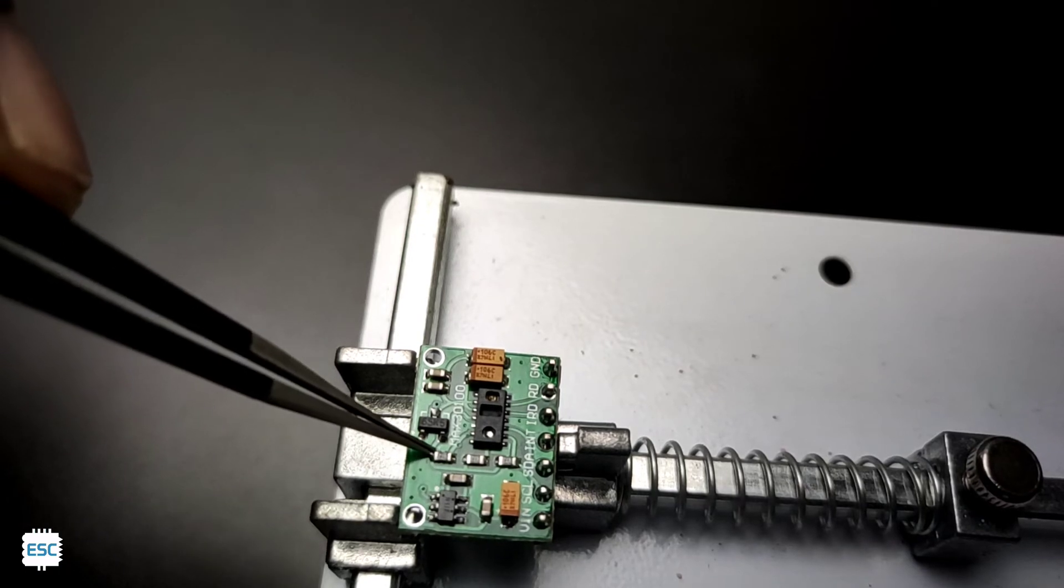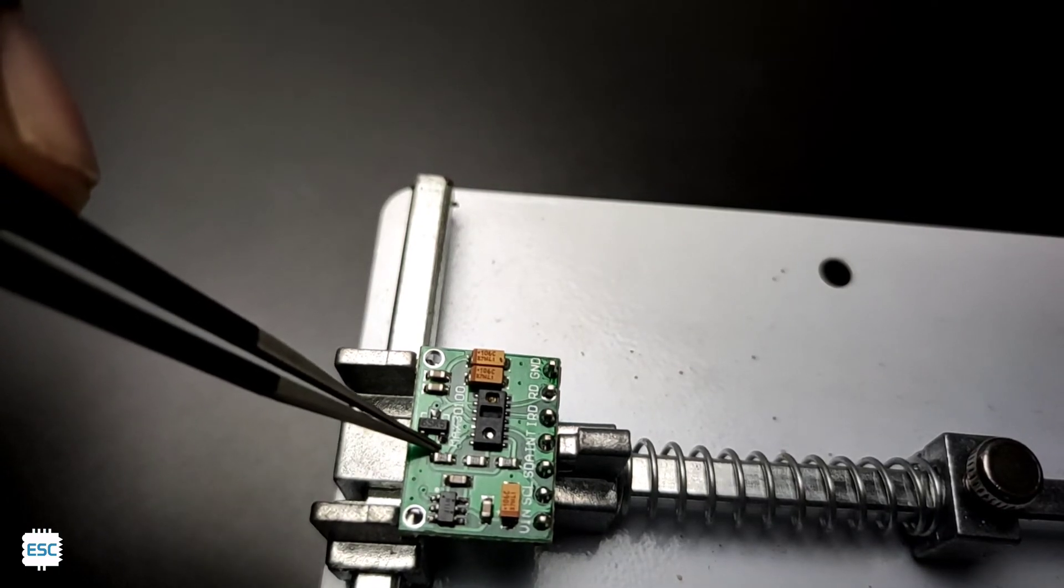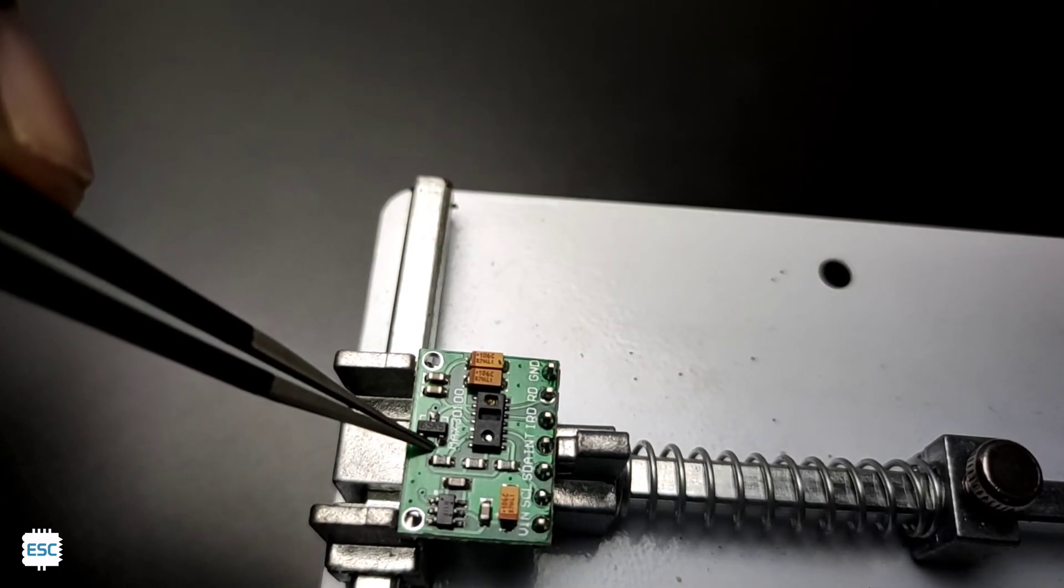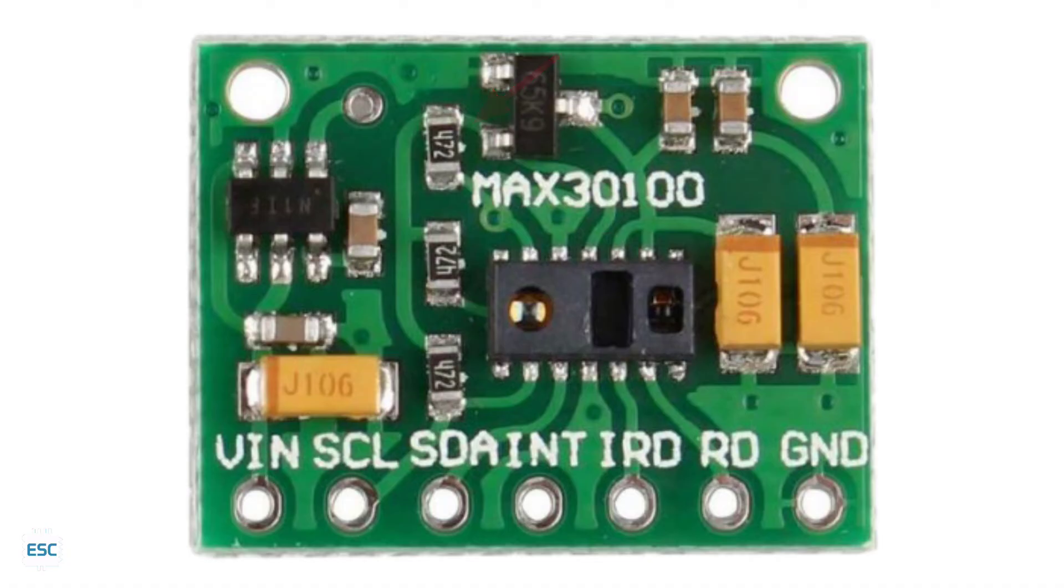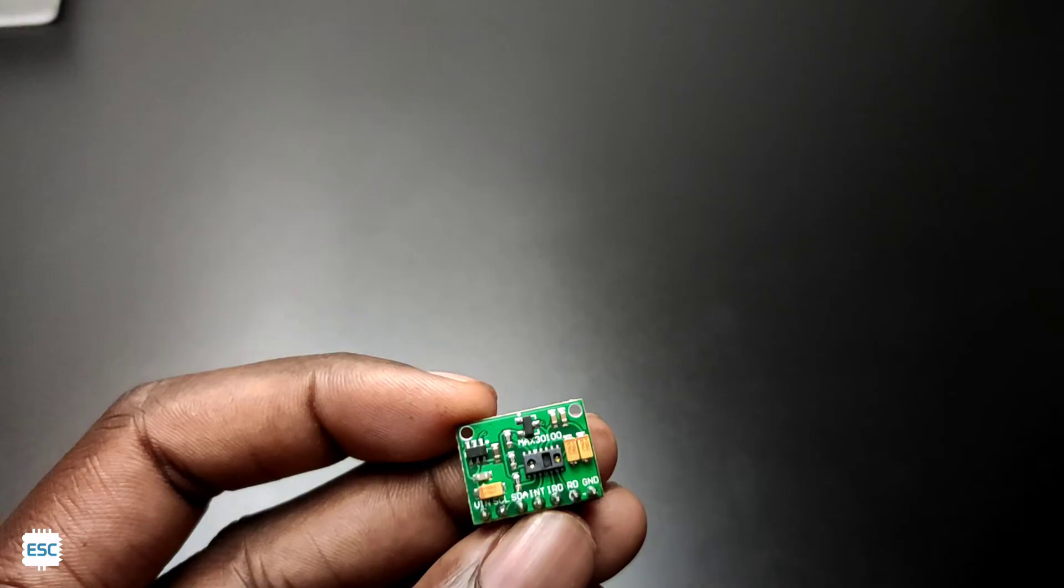Thankfully, we can fix this. To do that, first we need to cut this trace, then connect this resistor to the side of the voltage regulator.